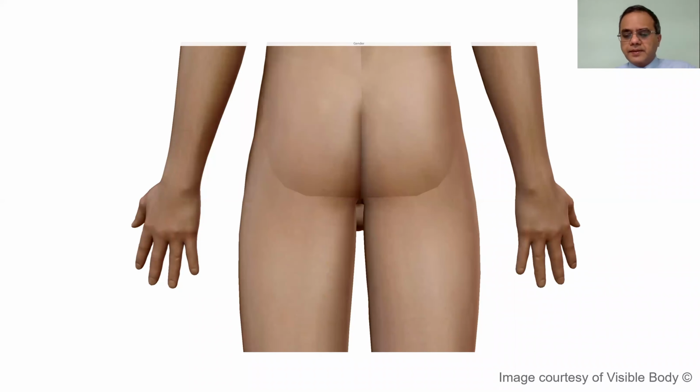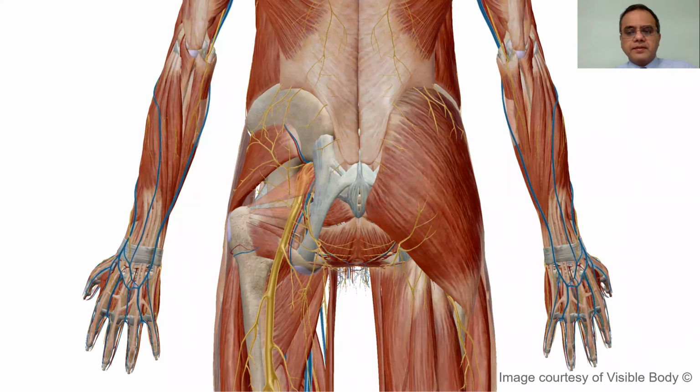In this, a curvilinear probe is used again, and in this picture you can see on the right hand side the gluteus maximus muscle, and on the left hand side I've removed the gluteus maximus muscle to reveal the sciatic nerve coming out of the greater sciatic foramen, going underneath the piriformis muscle, passing between the greater trochanter over here and the ischial tuberosity over here, and at this point lying over a muscle called quadratus femoris muscle. Now all of this will be covered by the big gluteus maximus muscle.